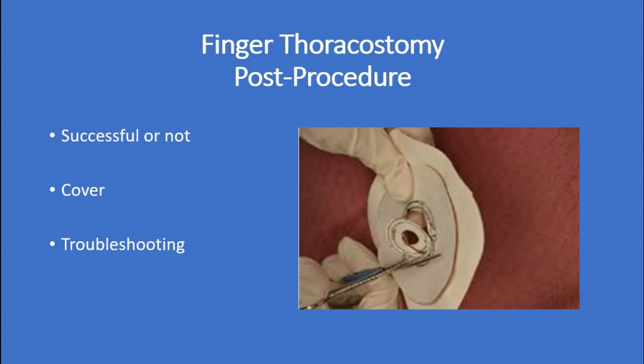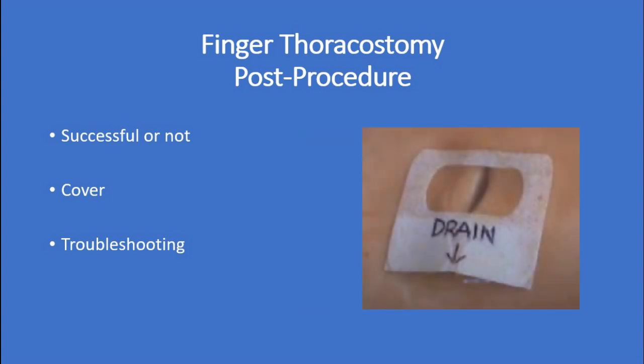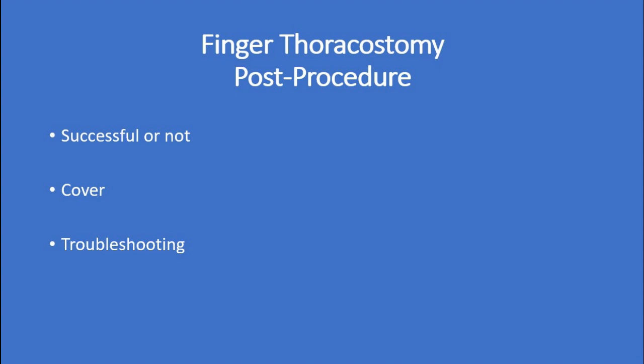Services will have specific dressings to be utilized. Within Ambulance Victoria, a stoma bag dressing is to be placed over the incision. Other services utilize a clear 3-sided dressing to allow continued draining but ease of access to re-decompress if needed. Some potential problems when completing the procedure is air not being released, which can be prevented by ensuring we are in the right landmark and sufficiently poked through the intercostal muscles.